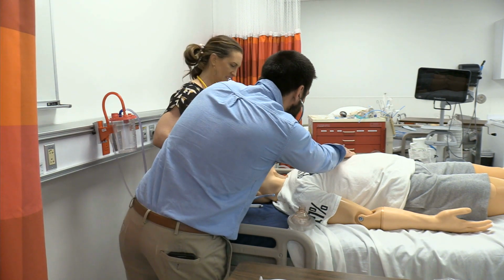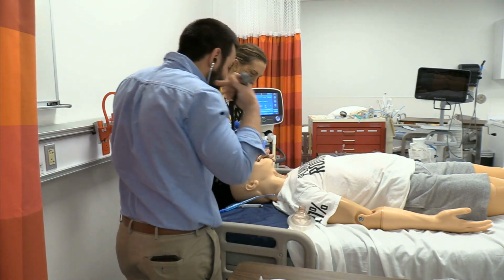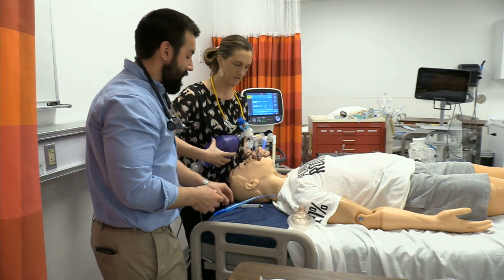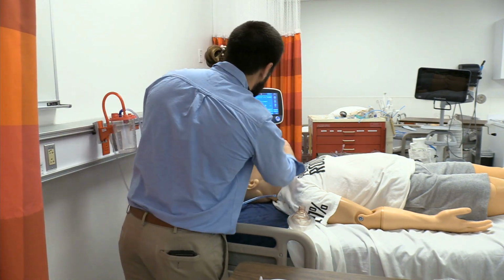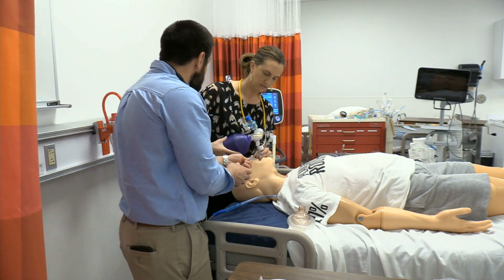Yeah. So we got a little bead of color change, but only breath sounds on this right side here. So we know we're in the airways, but I think you went a little bit deep there, and we're probably in the right main stem. You got in the right spot for the most part, though. You just want to continue to stay connected. Alright, hang on to that tube. So what we're going to do here, I'm going to tell you when the cuff's down, and I just need to pull back.